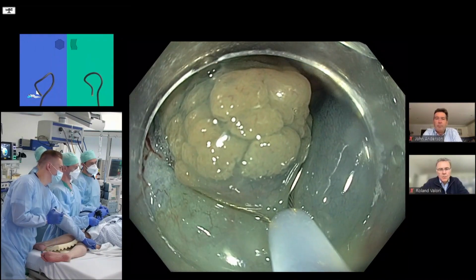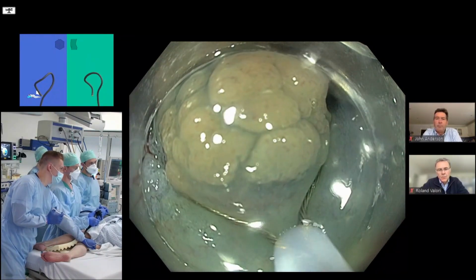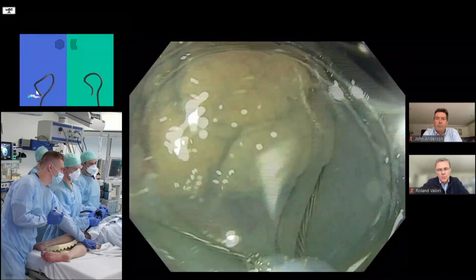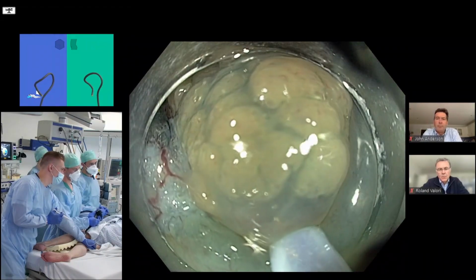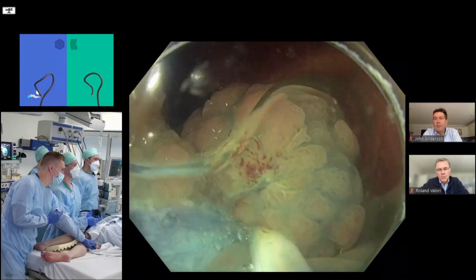It's just a little bit too much push out, I think, in between the two. No. Push out a bit. Yeah, that's good. All right. Suction. And then, yeah, we'll do it. Slowly close. Get that. Yeah, well done.